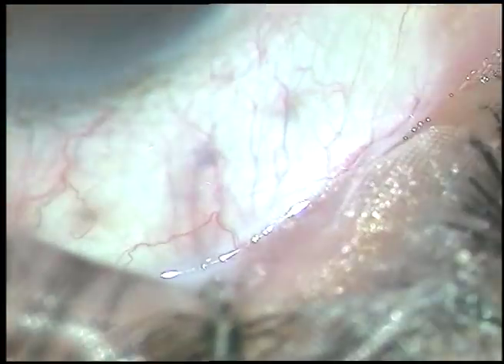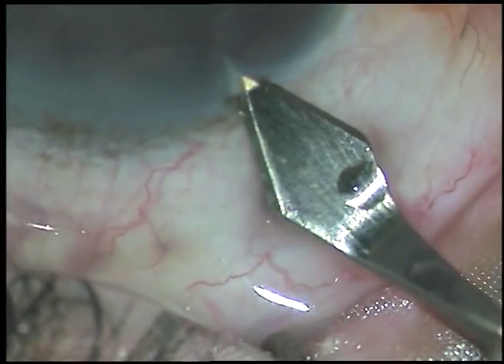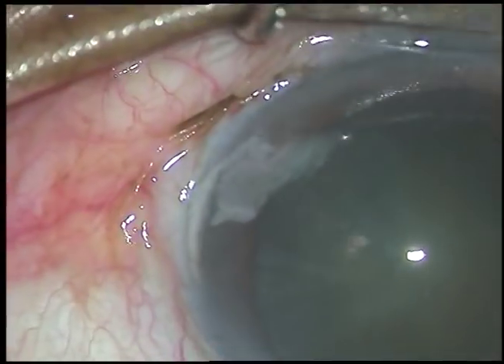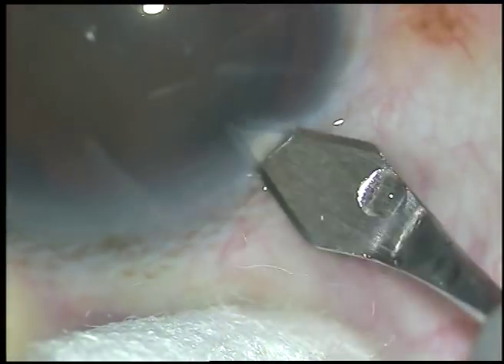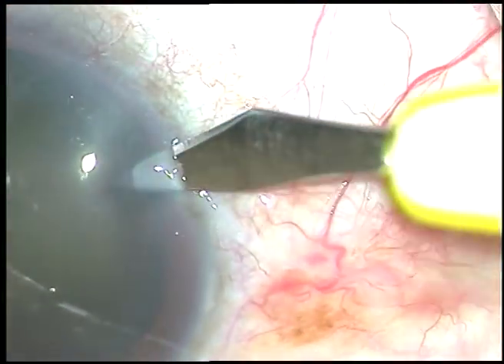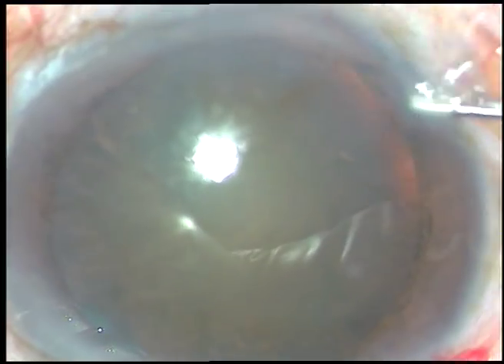Friends, this is a routine phacosurgery — let us watch the surgical steps. This is the main incision; it's a 2.8 millimeter posterior limbal incision. The patient is under topical anesthesia and we have to frequently instruct the patient to get some cooperation. This is a side port on the right side of the main incision.